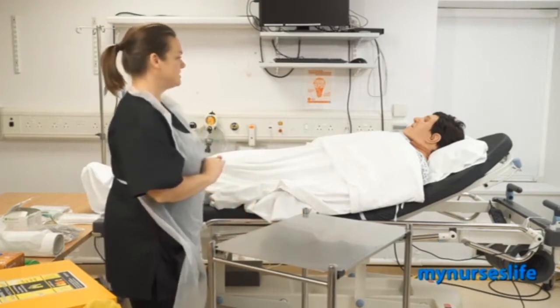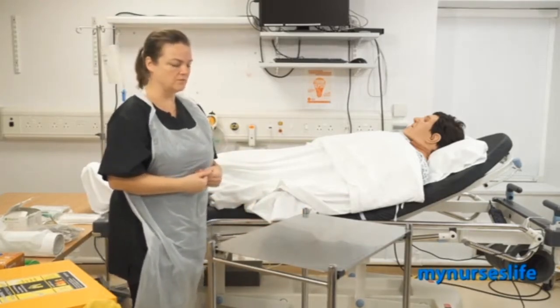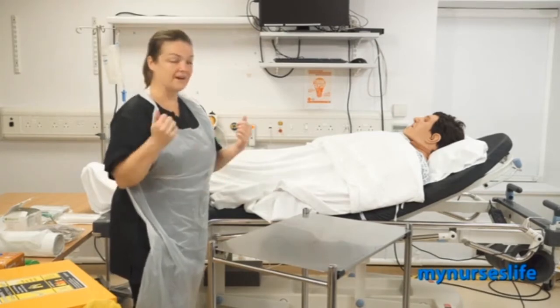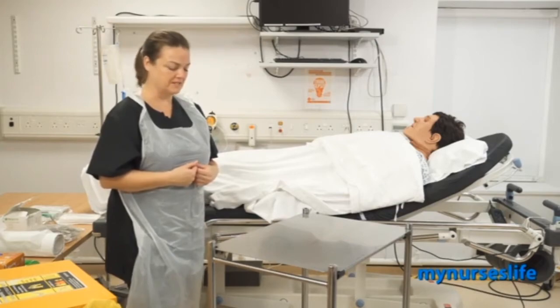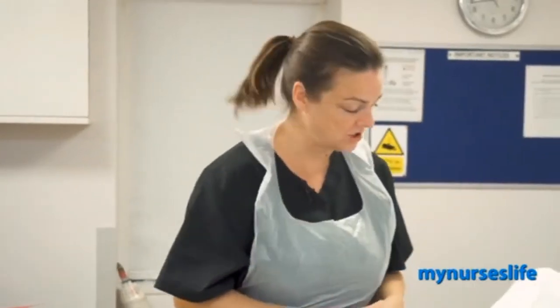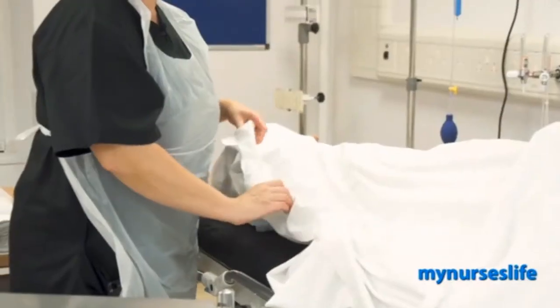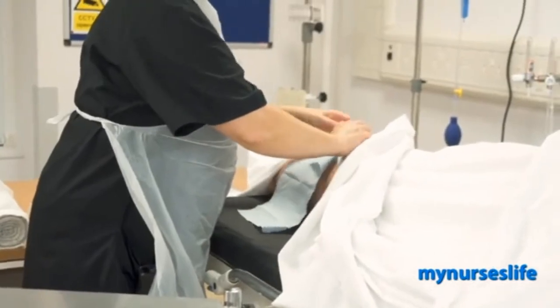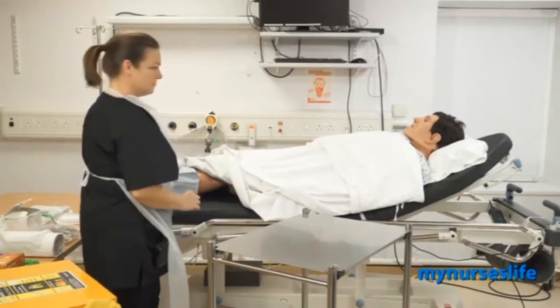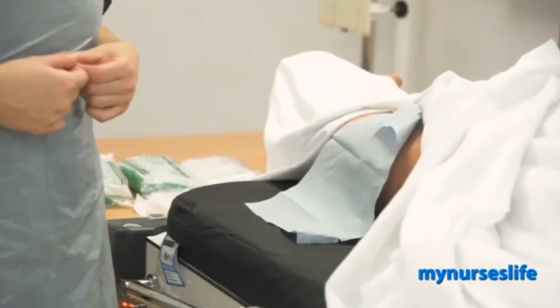So are you still okay to go ahead with the procedure? The patient has agreed to go ahead with the procedure, so again I'm going to shut the door and make sure that the area is screened for privacy and dignity. And I'm just going to lift the sheets back to the area where the wound is, and it's on the lower leg. I only need to expose a minimum part of the leg.